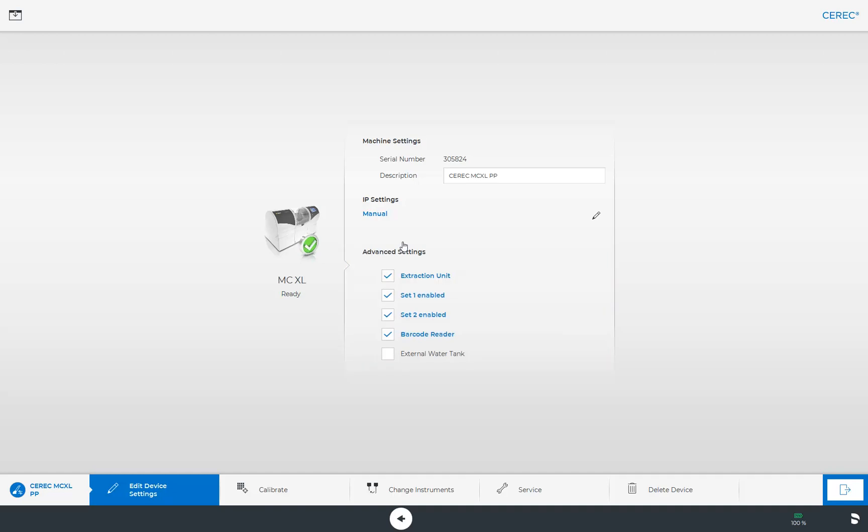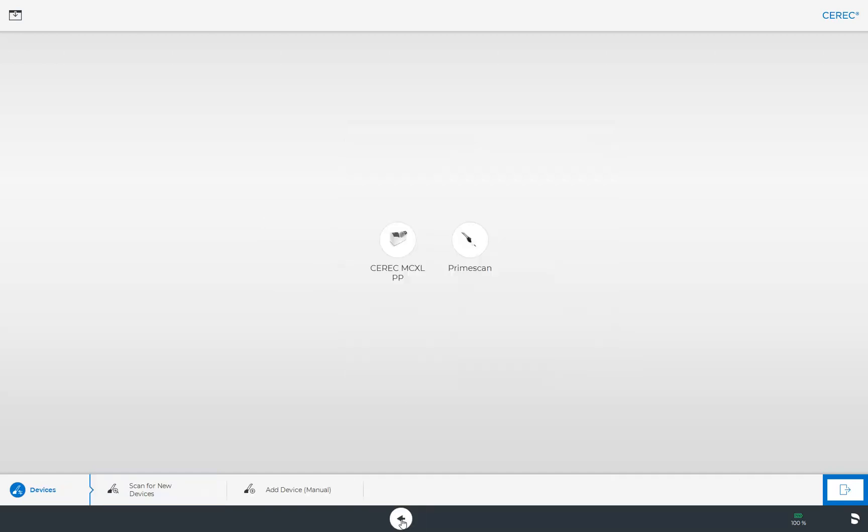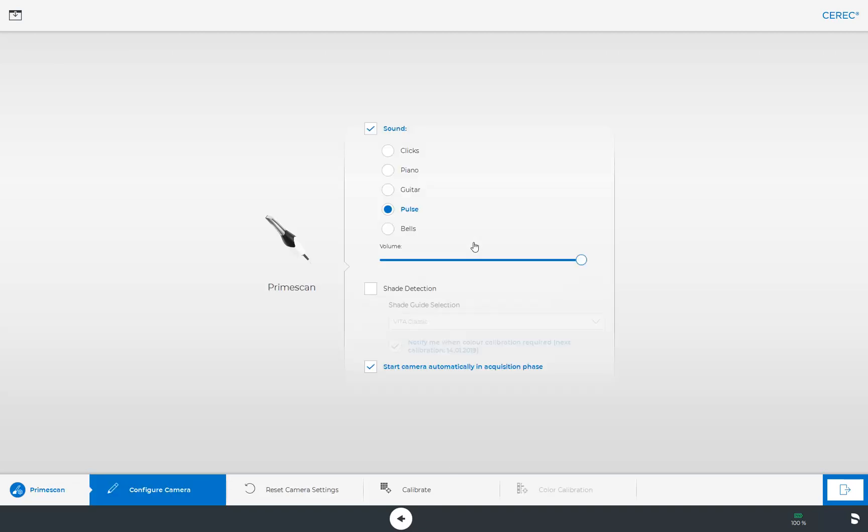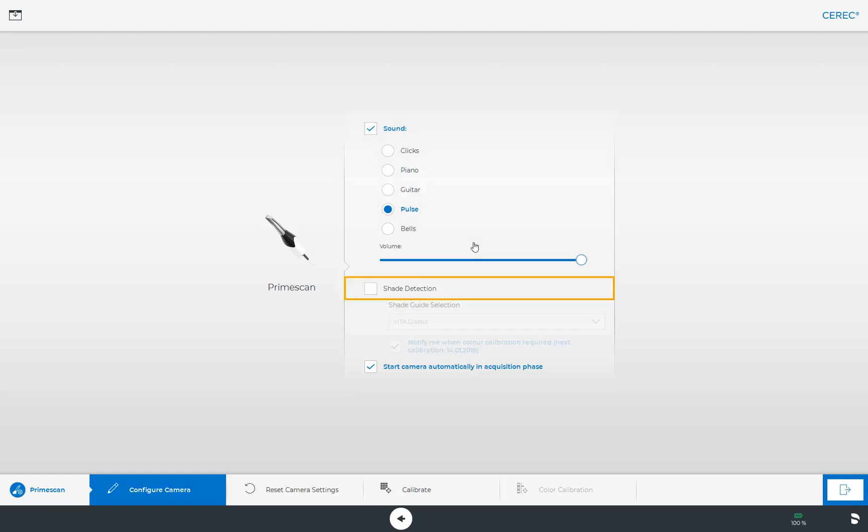Once again, we go back one step and choose our scanner, Primescan. We can also adjust different settings for our scanner such as sound and volume or turn the shade detection on or off.